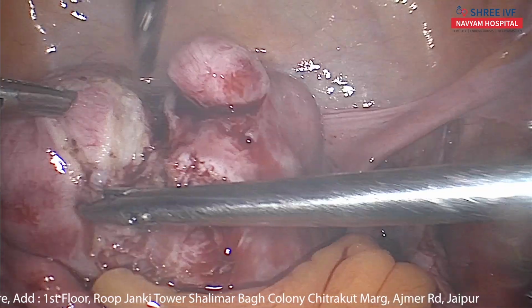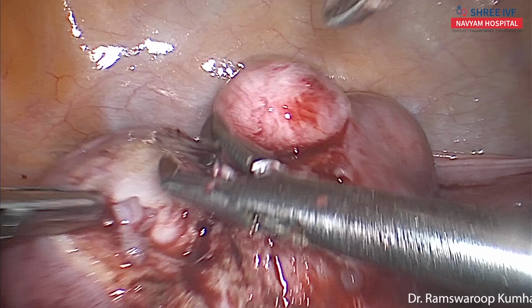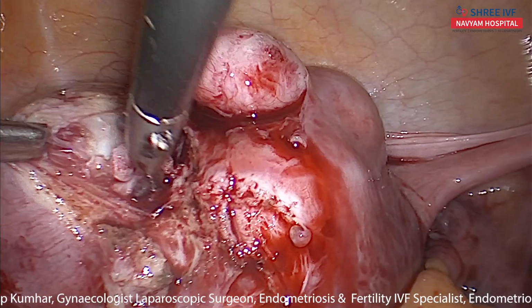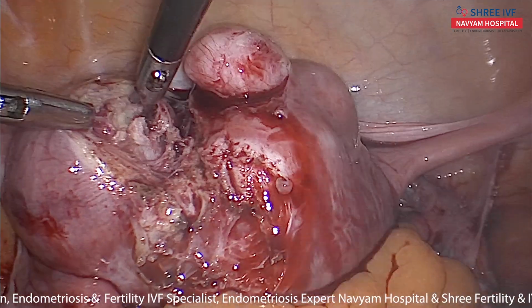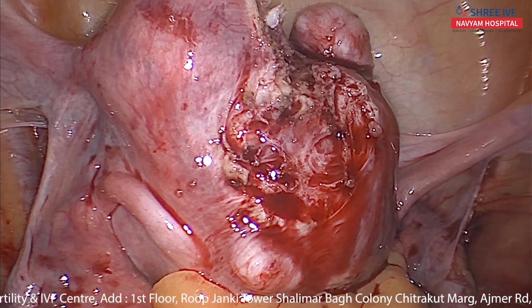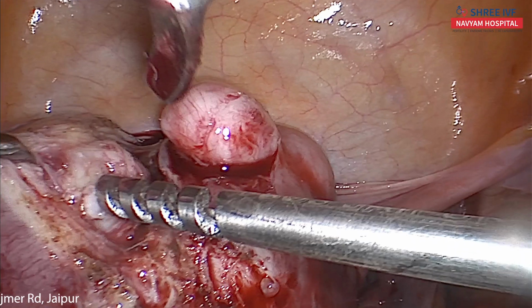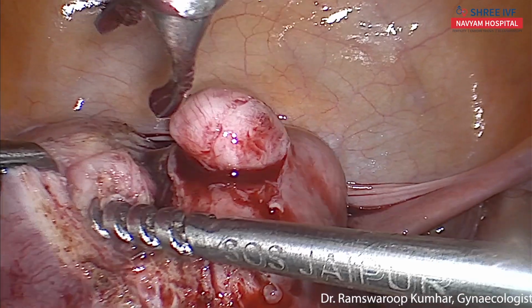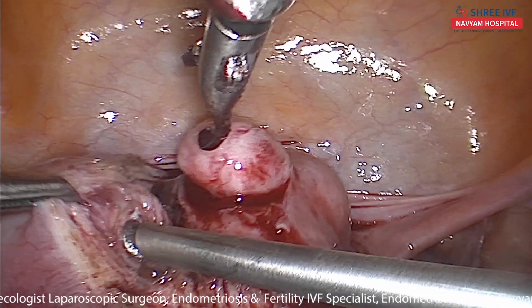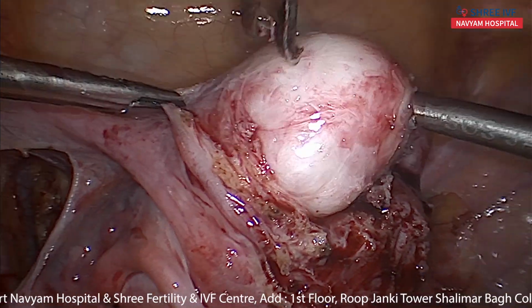This is the larger myoma again, and the technique is traction and counter traction, and the traction we will give by the myoma spiral. First, we have reached the plane. The myoma screw is a better instrument, and the traction will be provided, and it will enucleate very well.